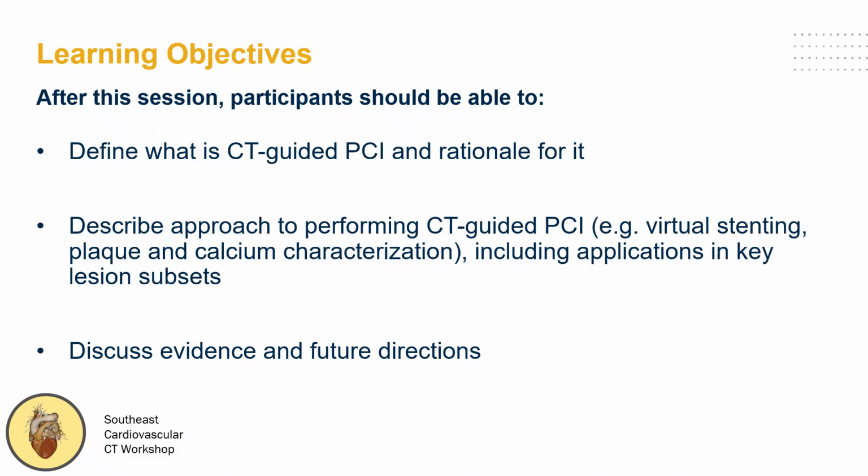So by the end of this session, I'd like you to be comfortable with three main concepts. First, what CT-guided PCI actually means and why this approach is becoming increasingly important. Second, how we can systematically use coronary CT for procedural planning, including virtual stenting, plaque characterization, calcium assessment, lesion preparation. And finally, we will review some of the current evidence and discuss where this field is heading moving forward.